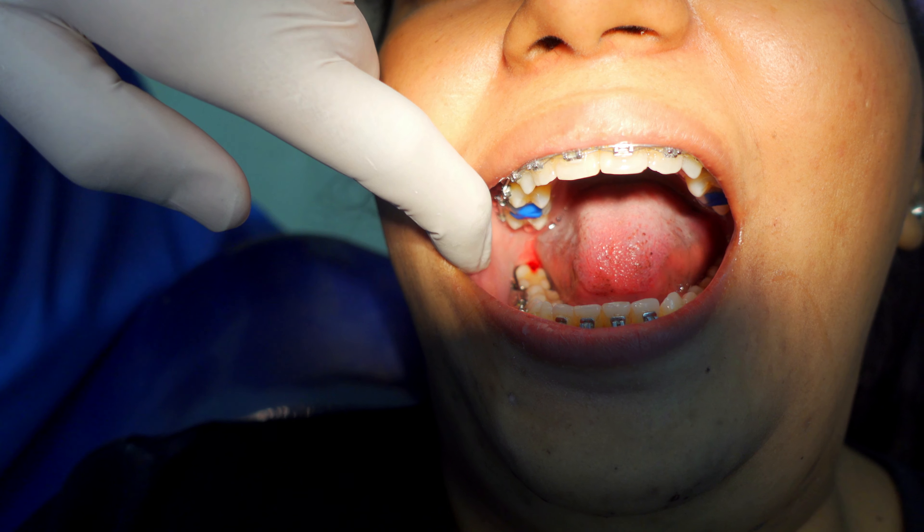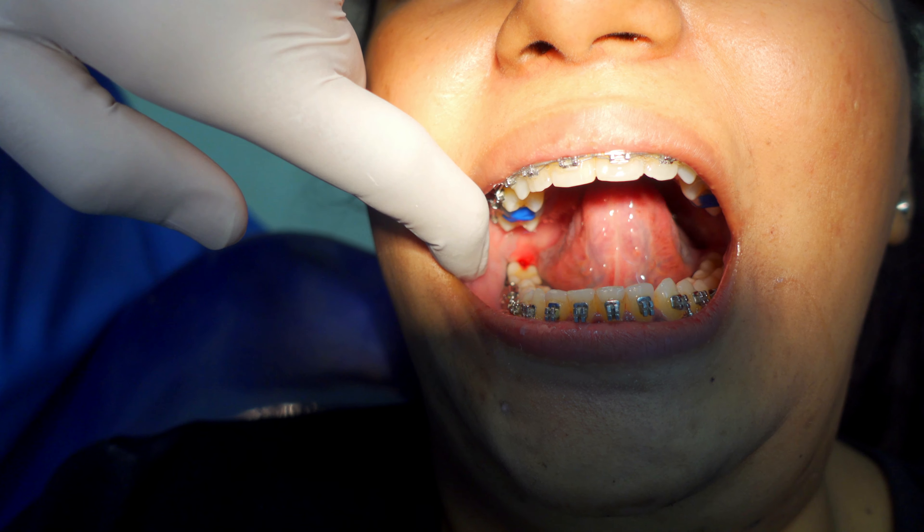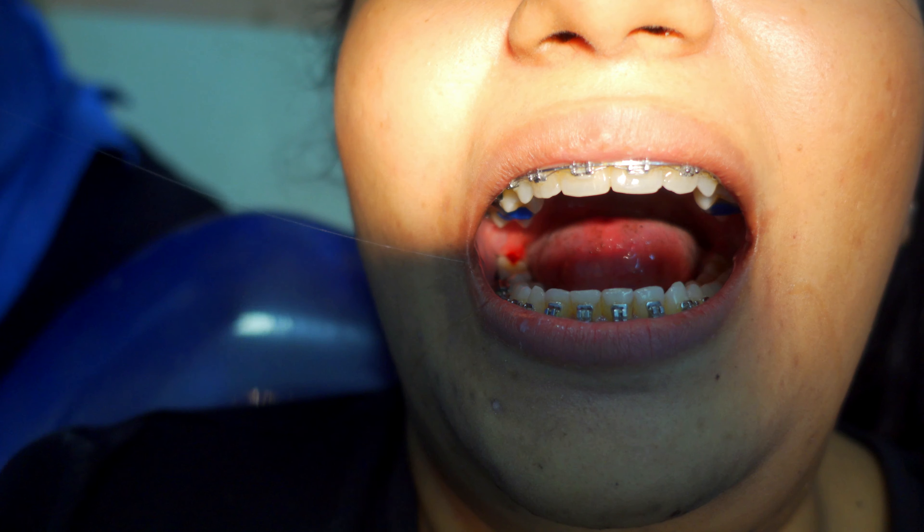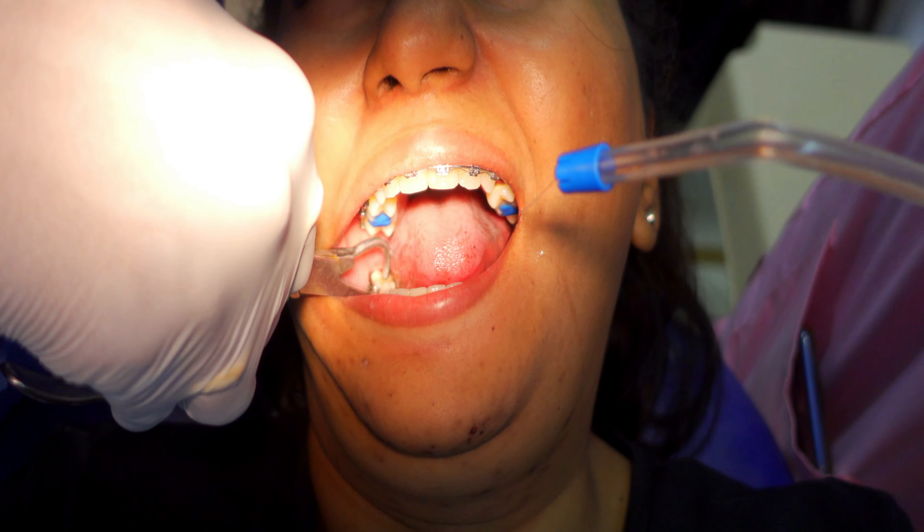They thinned the lower wire because they don't need to add more pressure. Almost 85 to 90 percent of my correction has been done. It's just this one particular tooth which is not straight. So the goal is to restore alignment between my upper and lower teeth. Basically, he used a smaller wire and continued the regular process with rubber bands.